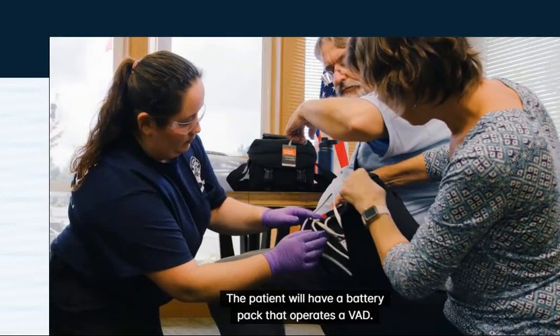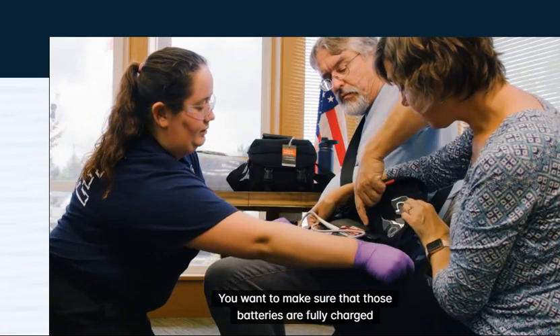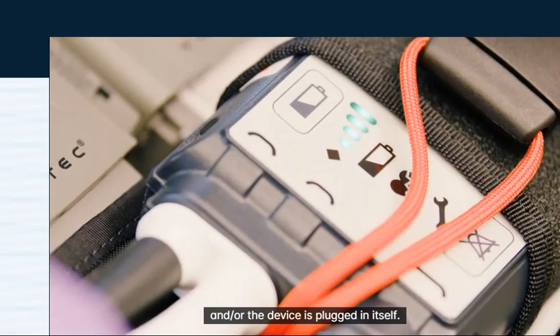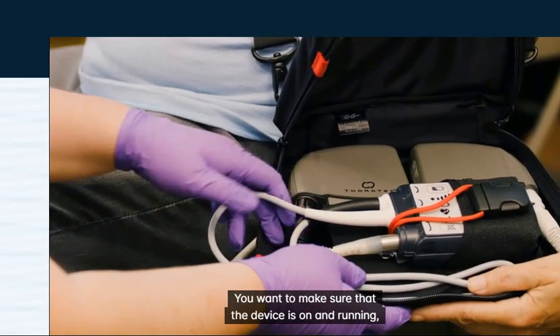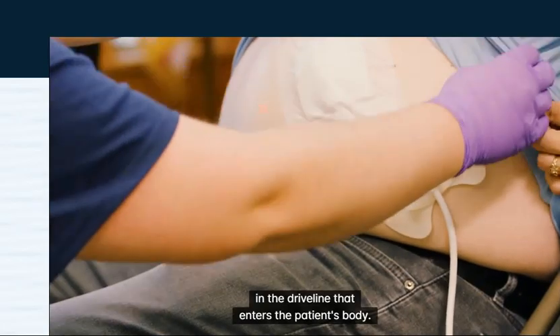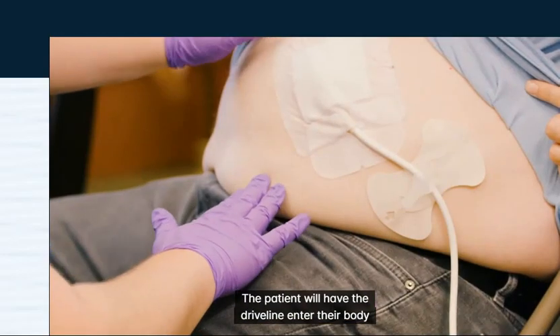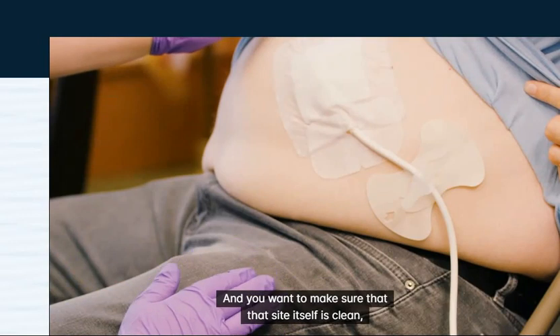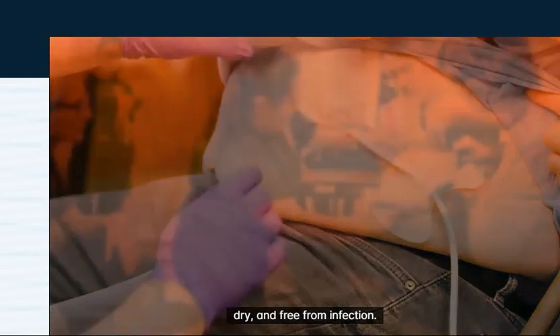The patient will have a battery pack that operates a VAD. You want to make sure that those batteries are fully charged and/or the device is plugged in itself. You want to make sure that the device is on and running, and that there are no kinks in the drive line that enters the patient's body. The patient will have the drive line enter their body in and around the lower part of the abdomen, and you want to make sure that that site itself is clean, dry, and free from infection.